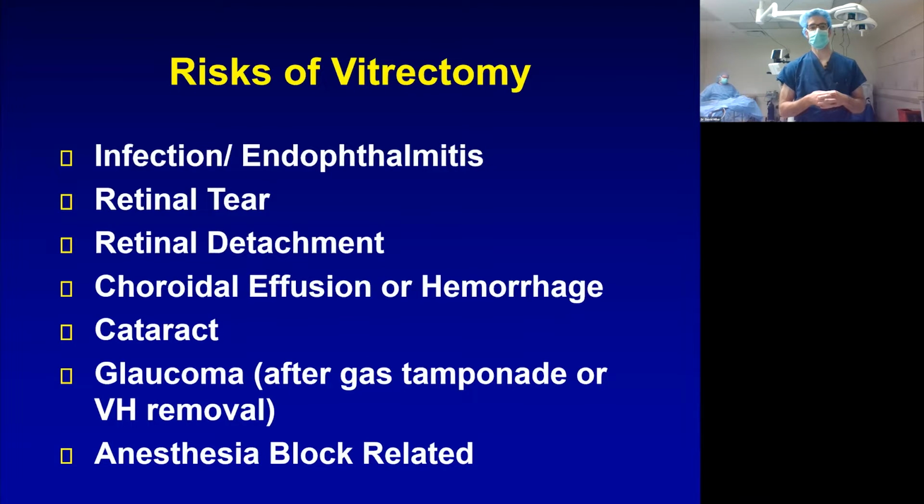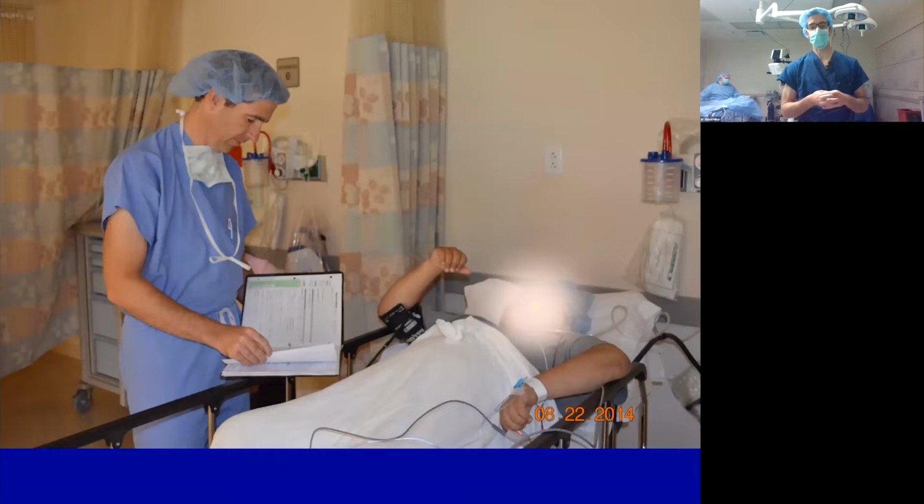So here you see us in the pre-op area, examining the chart, confirming the eye, discussing with the patient what the surgical plan and goal is.